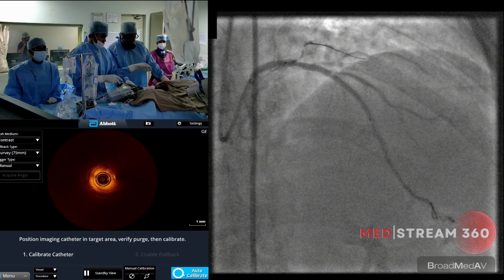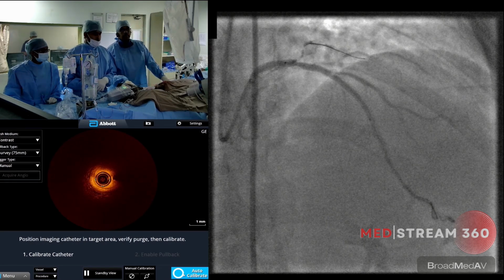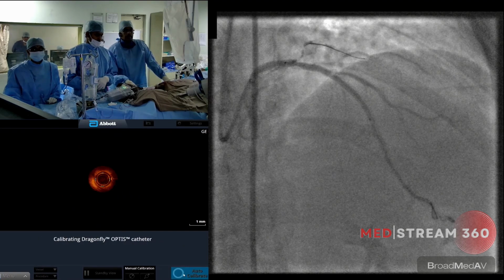Okay, everybody ready? Port is ready, pressure injector is ready. Yeah, I'm taking a call, calibrate. Yes.